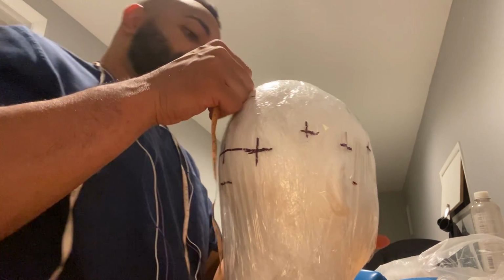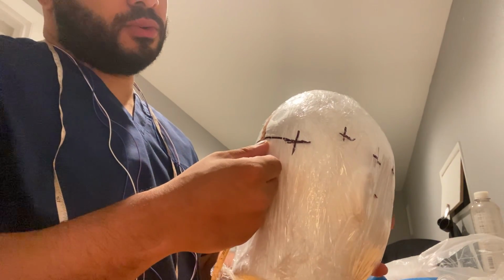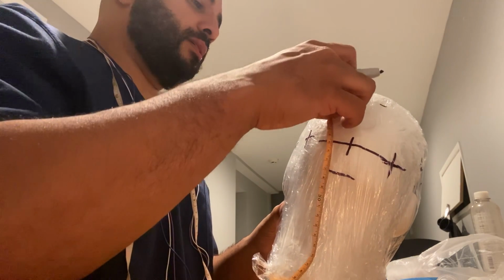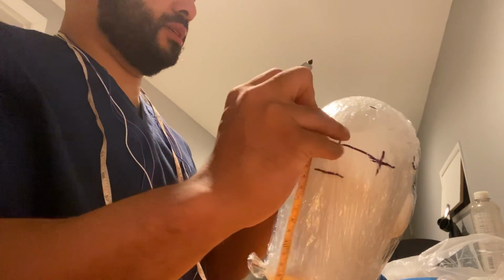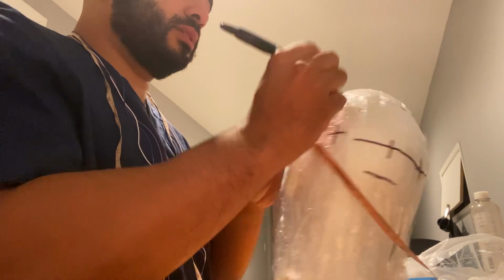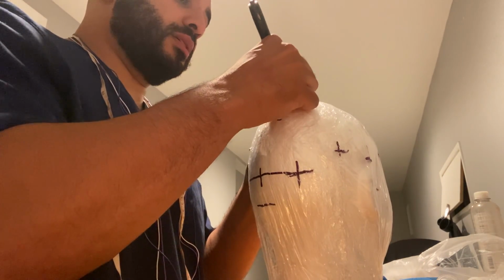I'm going to do parasagittal, which is on both sides of the sagittal measurement. I'm going to go from FP1 to O1. I get about 25, so that's like 6.25. So I take 6.25, I take 12.5, and I'll take another 6.25, which is right here. Let's cross these X's.